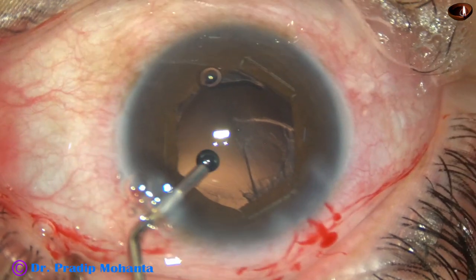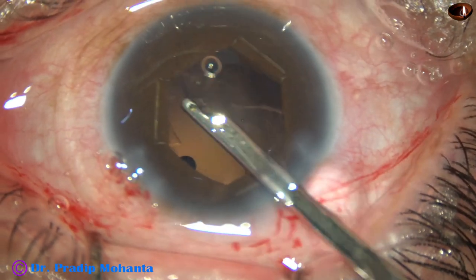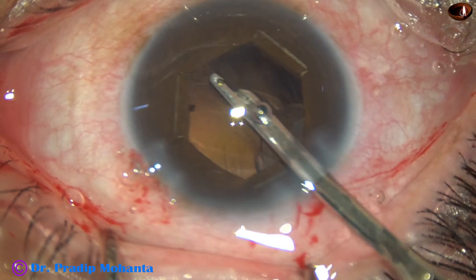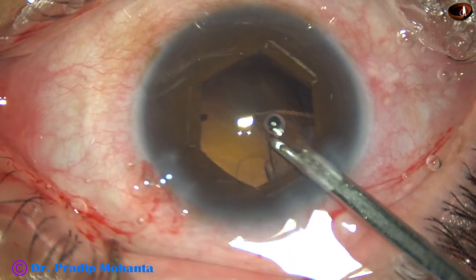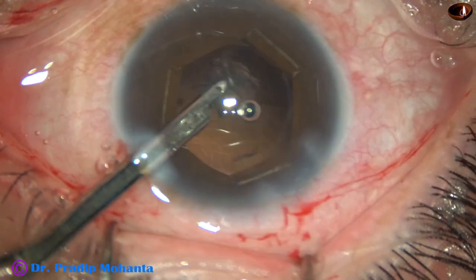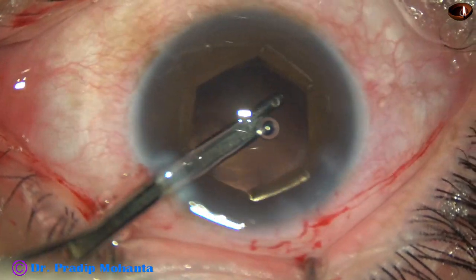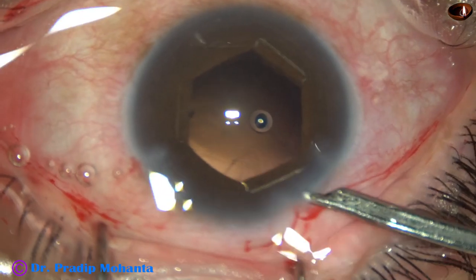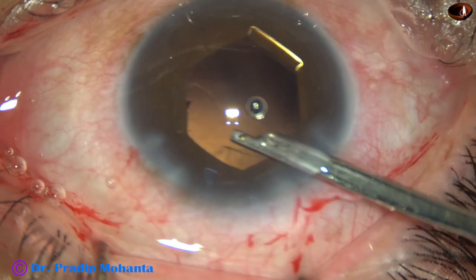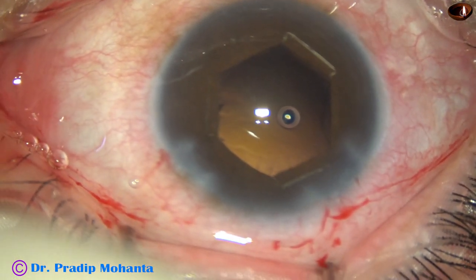2% HPMC is filling out the capsular bag, and this is being done to protect the corneal endothelium. Now this is completion of cortical cleanup. Cortical cleanup is done nicely; a few fibers are here and there — we can polish those later also.